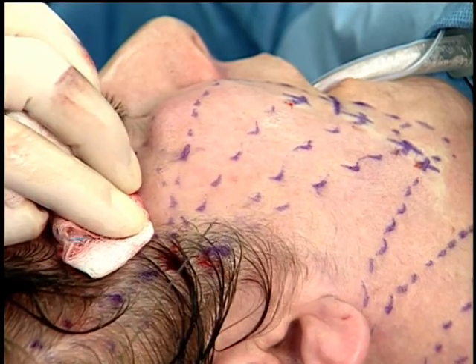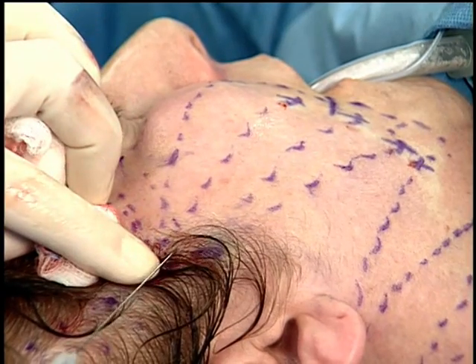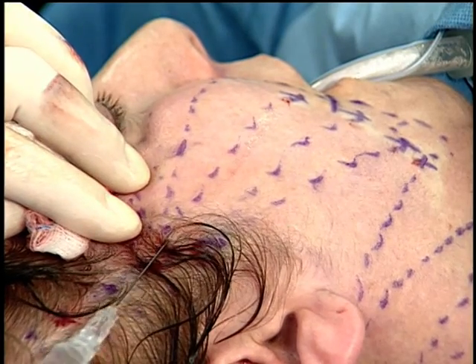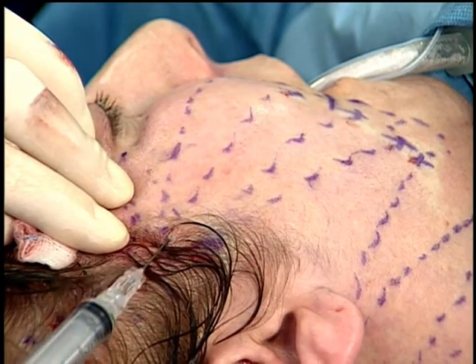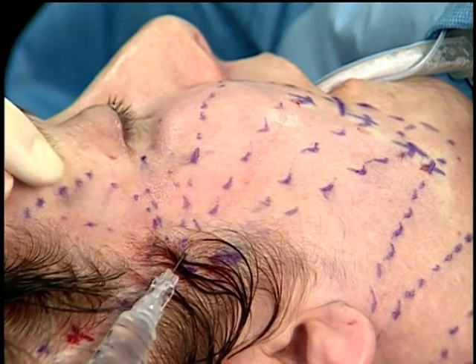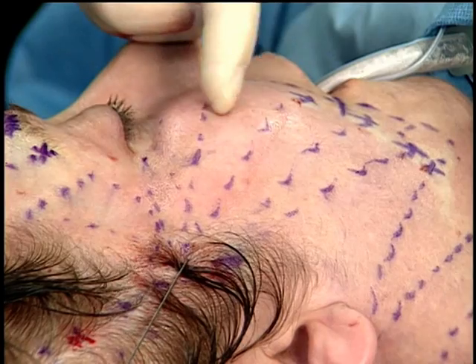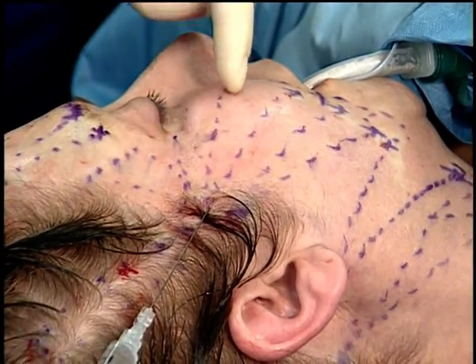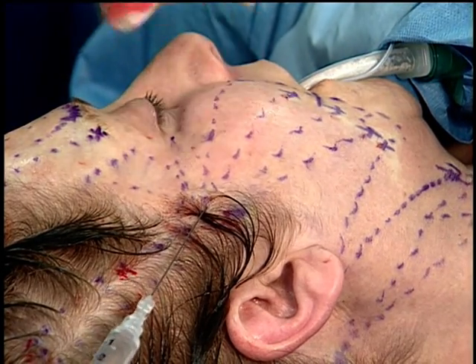Again, hydrodissect down our next trajectory right here from our anchor deployment port for the second limb of our first loop lift. Hydrodissect on the way down and then inject on the way back. If you don't have quite enough fluid, remove your syringe, add the next one, and hydrodissect on the way back. Now there's enough diffusion vertically and horizontally that allows you to do tissue dissection in this plane between the two threads without having to actually infiltrate it.